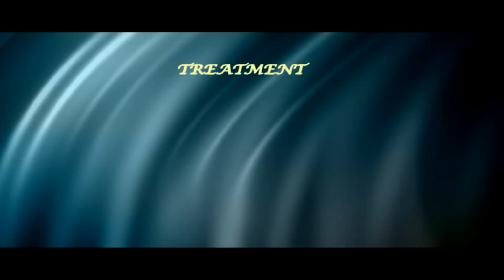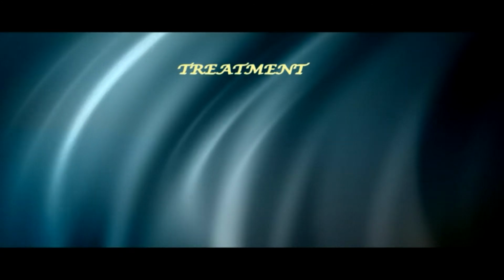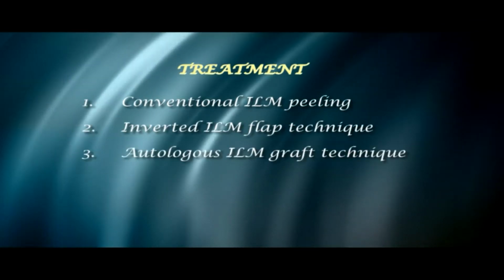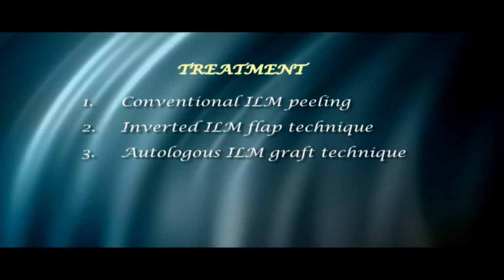Of the many surgical techniques described in the literature for macular hole repair, we present conventional ILM peeling, inverted ILM flap technique, and autologous ILM graft technique. We begin with a video recording showing conventional ILM peeling, a technique first described by Eckhart in 1997.